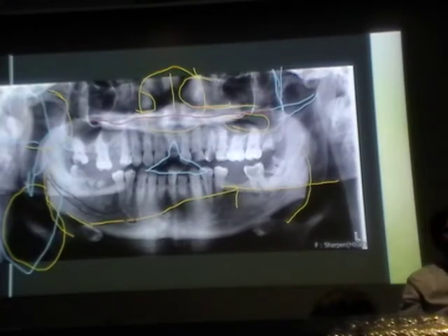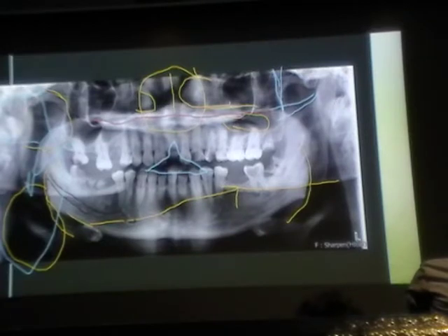On your image where you identified all the parts, it looks like you identify it as the palatoglossal airspace. Yes. So is that correct for where that yellow circle is that also displayed out? Yes, you are right. I'm correct.